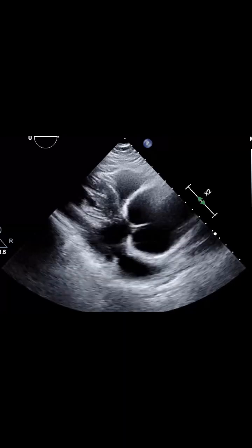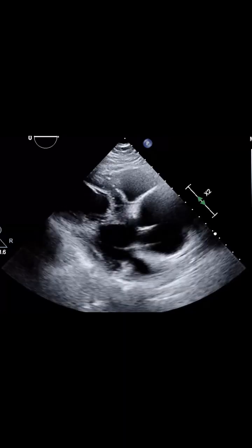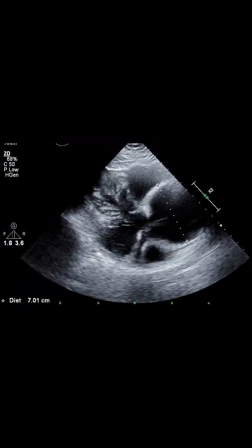In this PLAX view, the aortic root is clearly dilated. Measurements confirm that the aortic root is enlarged beyond normal.